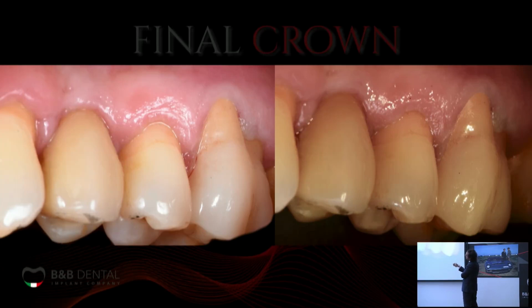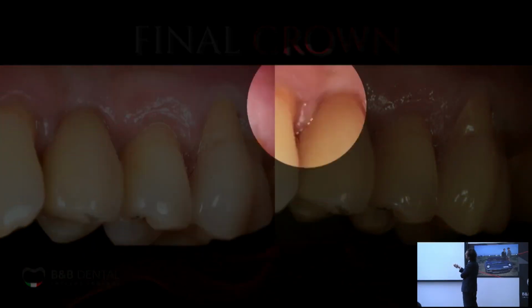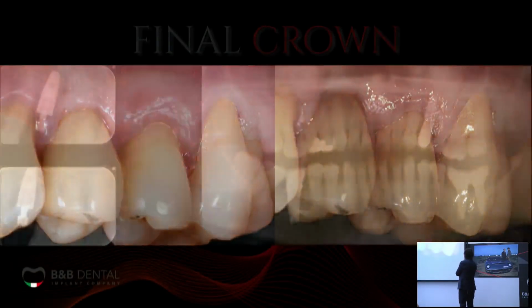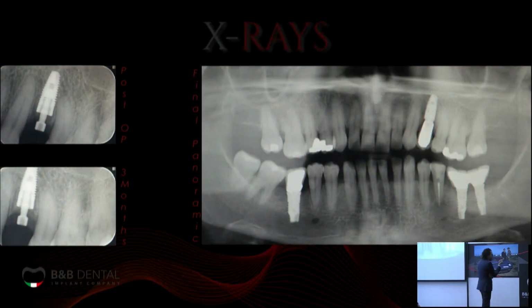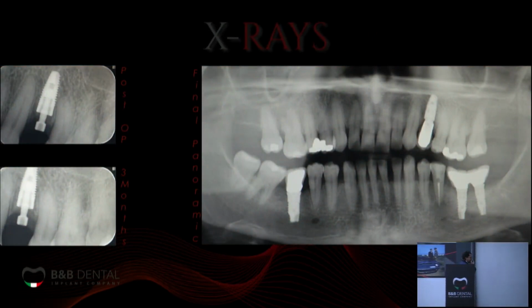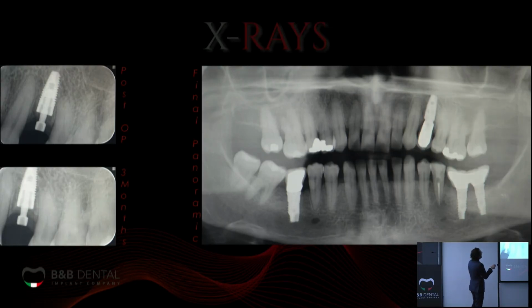And actually this is what we reach: the famous crown on implant, natural tooth, and crown on the natural tooth, all together, trying to go the closest possible to the restitutio ad integrum that we had when we started the rehabilitation.